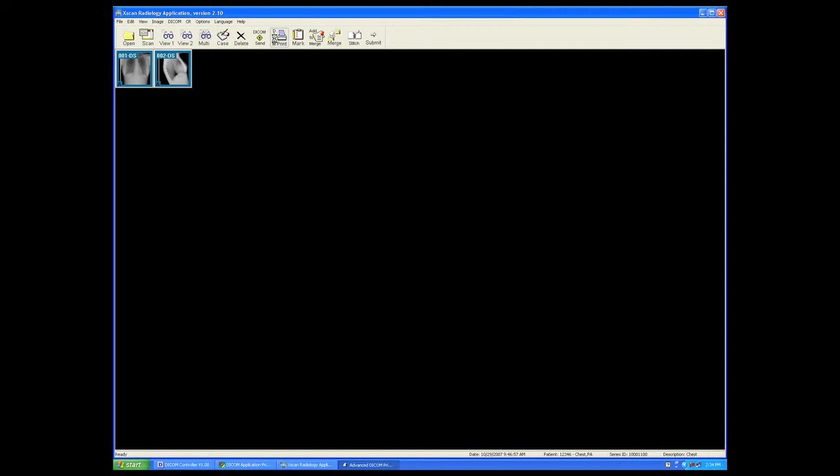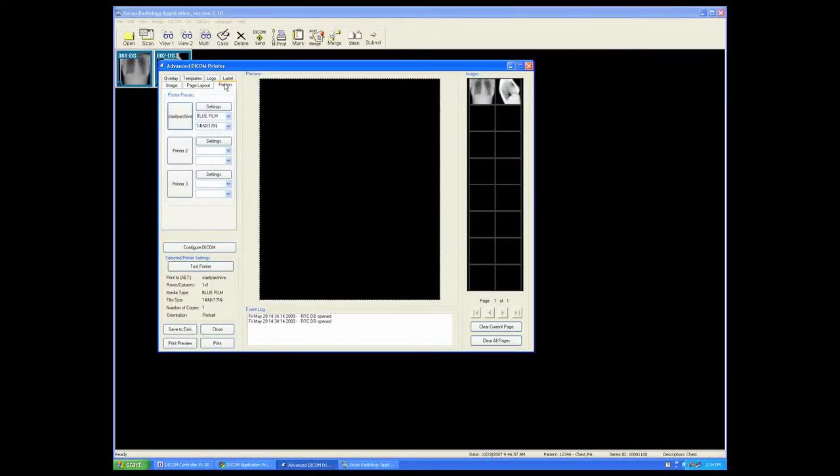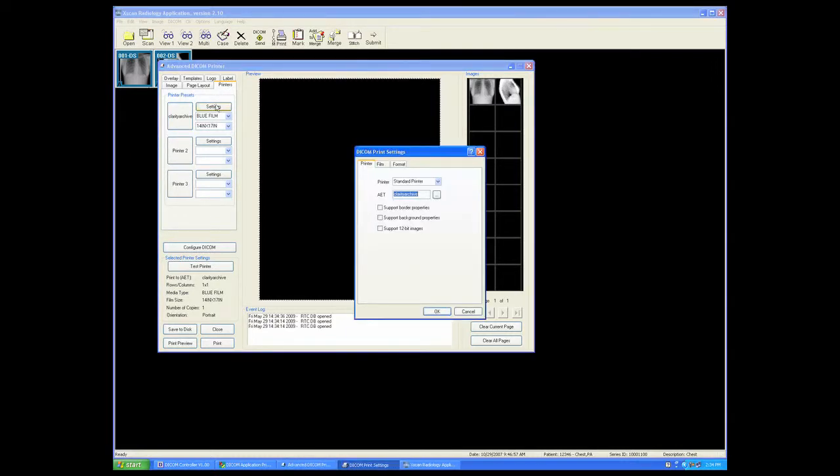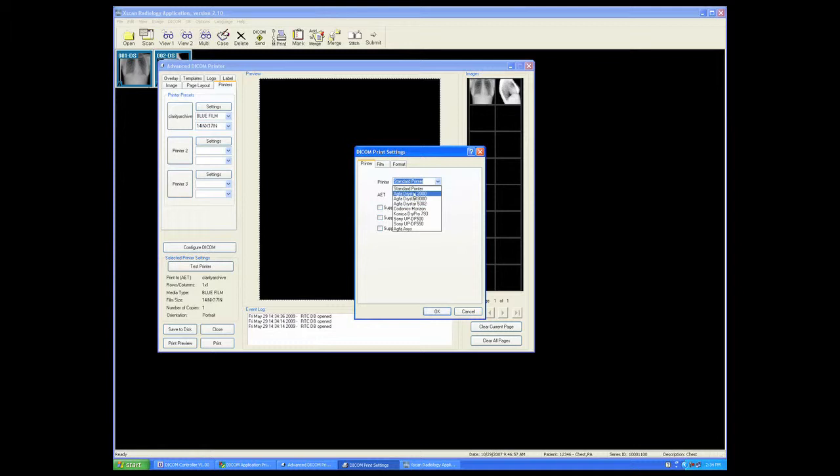From the thumbnail preview screen, select DICOM print. When the DICOM printer is launched, on initial setup, select the printers tab, select the settings tab, select the appropriate printer from the drop-down menu.